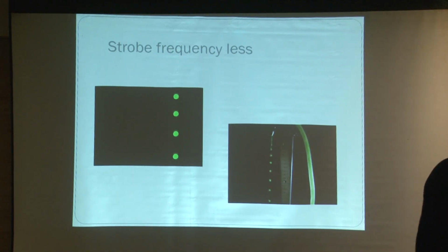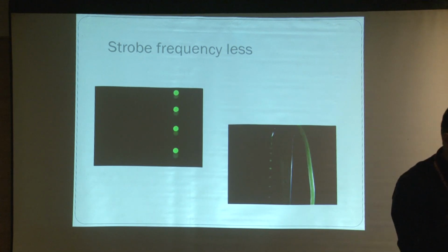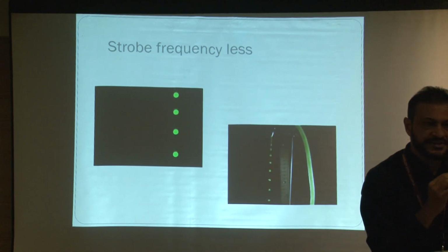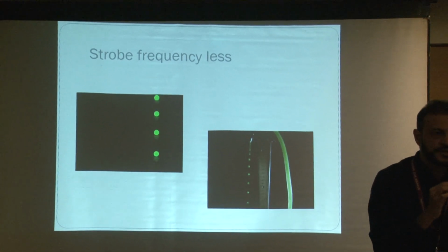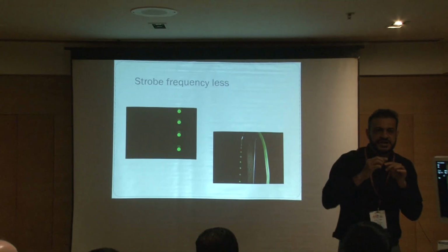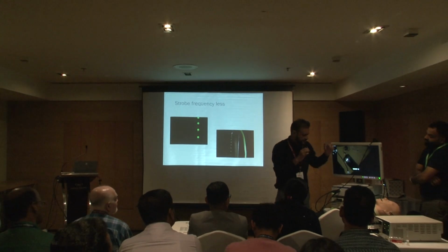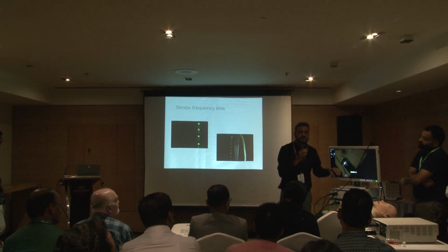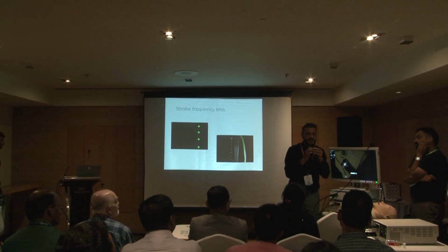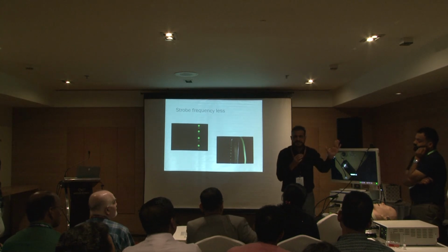The moment I use the mic while assessing, and I say I am seeing 190 here, this is F0, the fundamental frequency of my voice. So any voice assessment should start with noting down the fundamental frequency of the patient. Generally, mainstream, in males it is around 100 to 120, and in females it is around 200 to 220. So 120 males, 220 females.